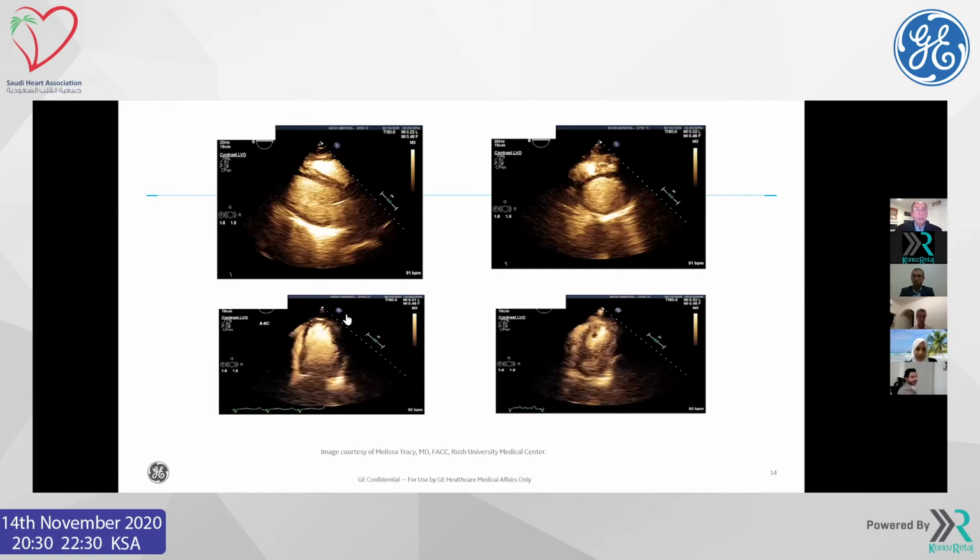But as we see the walls are very minimal in movement, then we start seeing trabeculation or something that makes it very suspicious. Then you'll start doing other scanning techniques to bring this area out, and maybe even zoom.